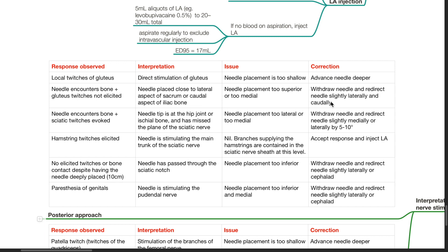Response: needle encounters bone with sciatic twitches evoked — interpretation: needle tip is at the hip joint or ischial bone, missing the plane of the sciatic nerve; issue: too lateral or medial; correction: withdraw and redirect medially or laterally by 5–10 degrees. Response: hamstring twitches elicited — interpretation: needle is stimulating the main trunk of the sciatic nerve — no issue; branches supplying the hamstrings are contained in the sciatic nerve sheath at this level. Accept response and inject LA.